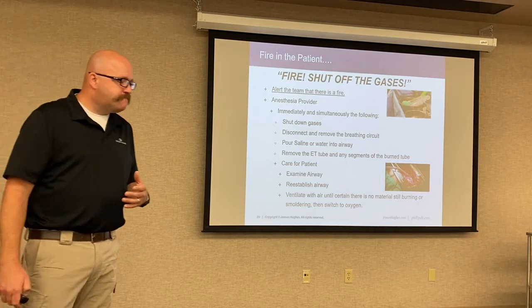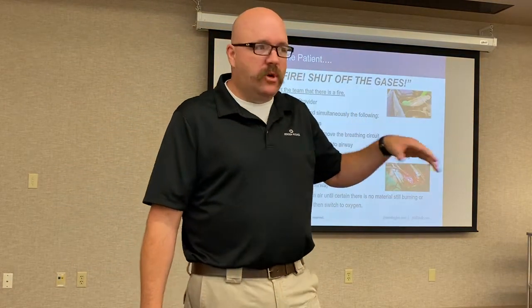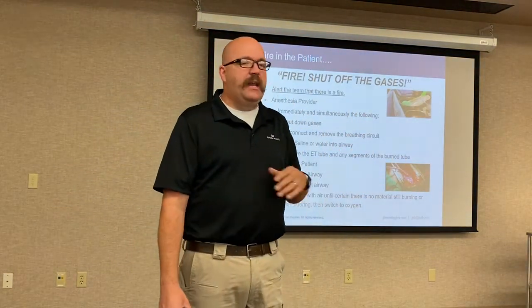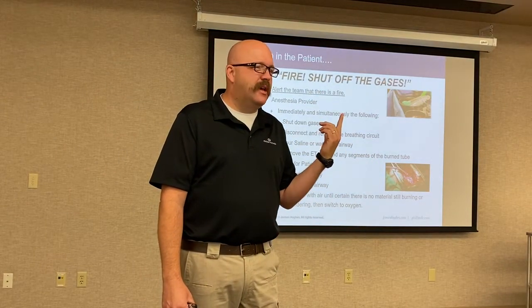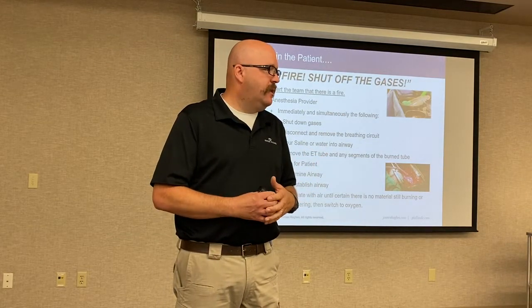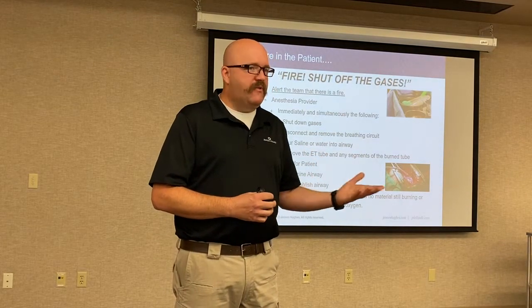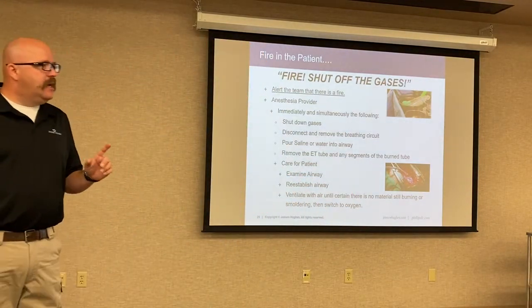Again, if it's on the patient, I'm going to demonstrate what that looks like with a fire on a pad, and you can all practice putting out that fire. I can show you what it looks like, but I'm more of a hands-on person, so it's easier for me to learn that way. So I'll have you practice putting out the fire, and it just makes it a lot easier.